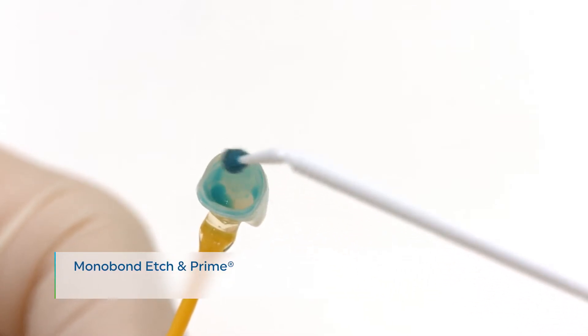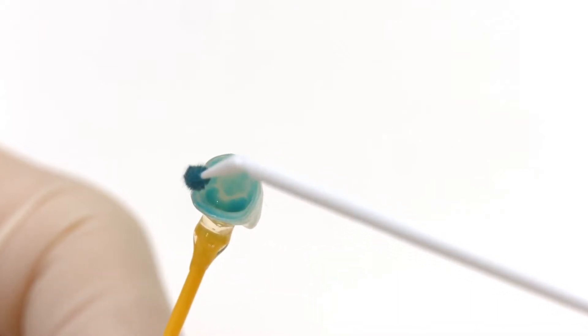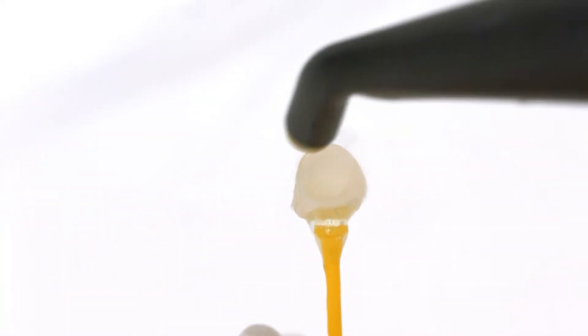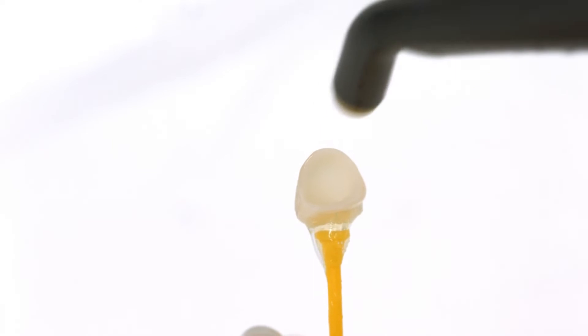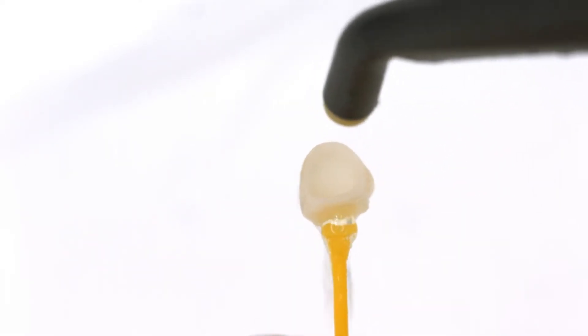Apply Monobond Etch-In Prime bonding agent to the bonding surface with a micro brush and rub it onto the surface for 20 seconds. Allow it to react for 40 seconds. Rinse off Monobond Etch-In Prime with water and thoroughly dry the restoration for 10 seconds with a strong stream of air.